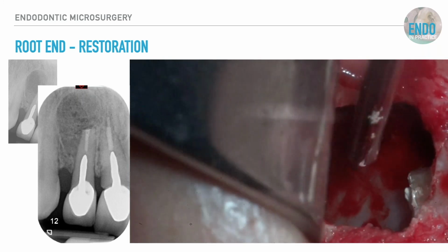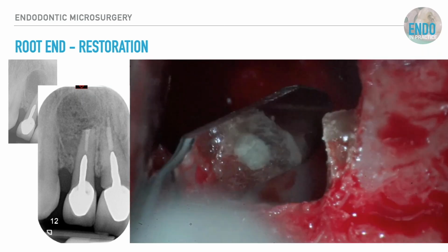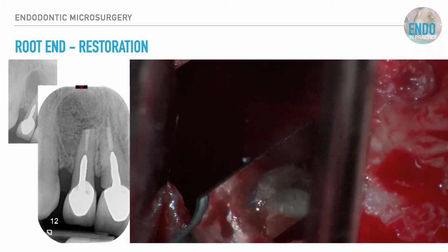And when you rinse it with saline, it washes off just the superficial layer. So that's why you saw me just add in a little additional layer at the top. And what you do not want is it smeared out over the root face, because that inhibits all those little cementogenesis cells popping onto the root surface and creating cementum and potentially a PDL. You just want it in the canal itself.